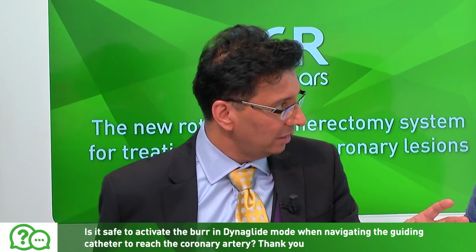And we've had another question about activating Dynaglide as a technique for getting the burr up to the vessel. I don't know if you have any thoughts on that. It's commonly used, but I don't know if there's any issues or you'd warn against any techniques like that. I mean, personally, it's not a technique that I use, and obviously what you might be doing that for is to just advance the burr quickly up the guide catheter.